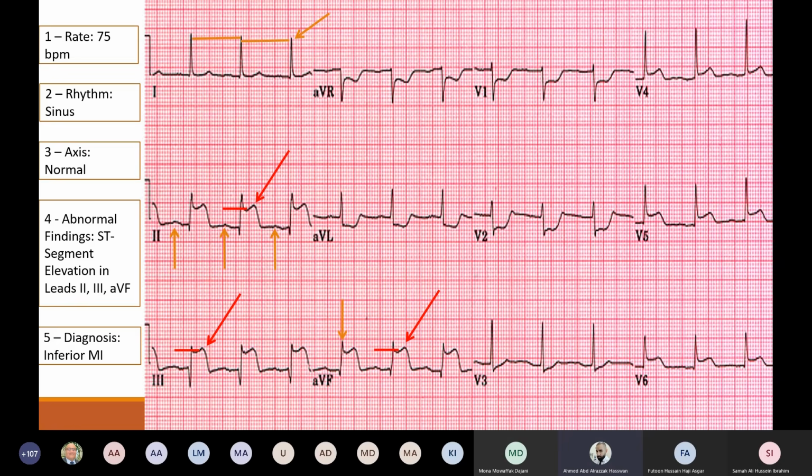This is what we look for in patients with acute MI, and this is what we look for in patients where we ask them to do the stress test. Once they have ST depression, we stop the machine. I don't know if you have seen it. ST depression is a sign of ischemia. If we don't act quickly, it might evolve into ST elevation and MI.